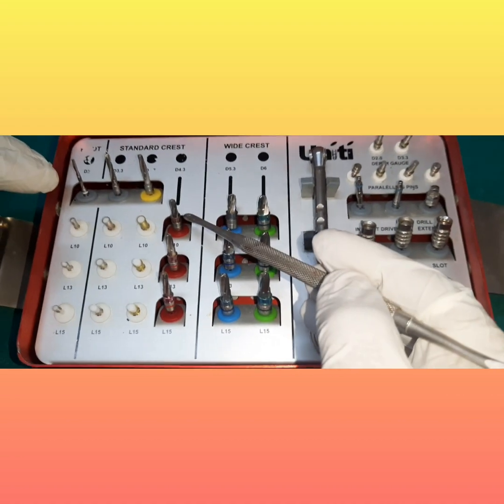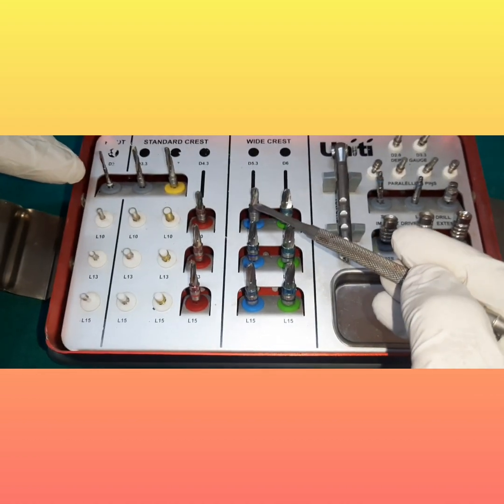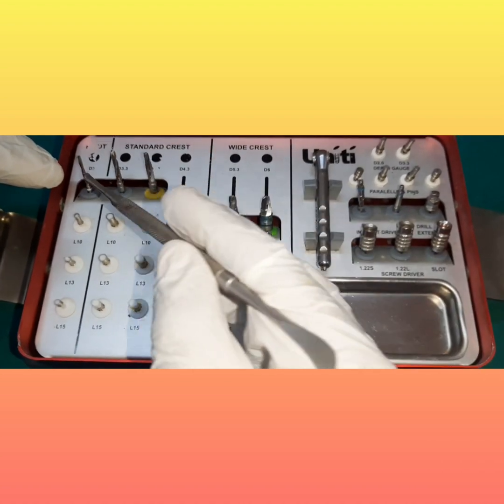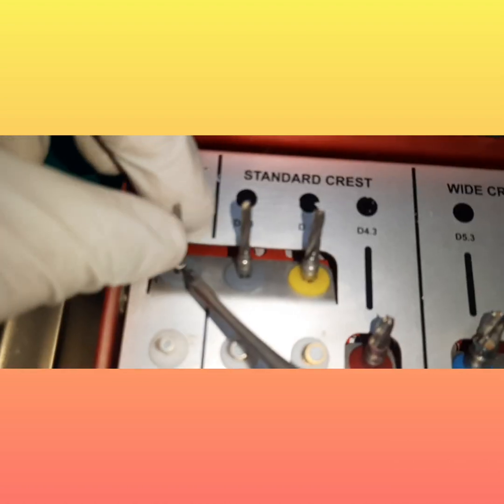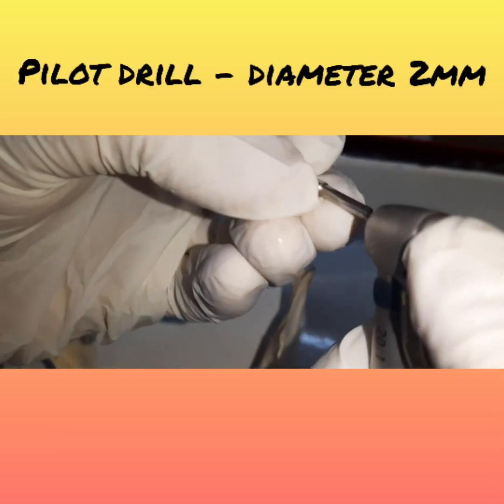Now I have planned to place say a D 5.3 implant till 10 millimeters. So the first thing which I am going to do is take the first drill like this, and I'll be placing it into the handpiece. It's very easy. Just press it in, lock it, and always check it.